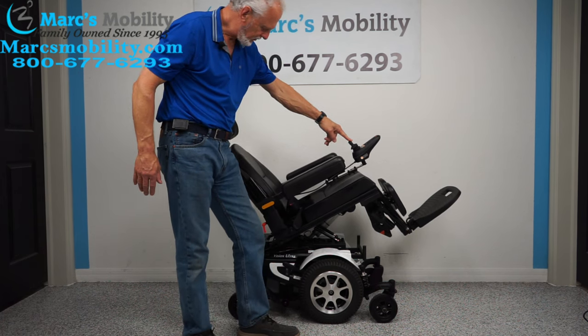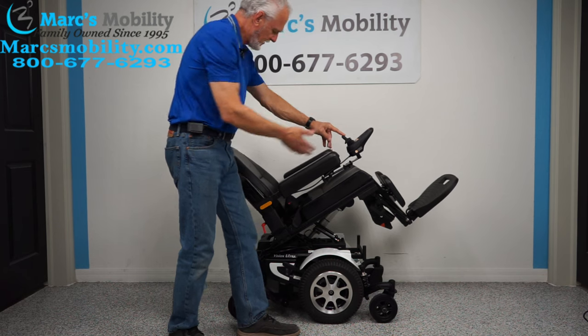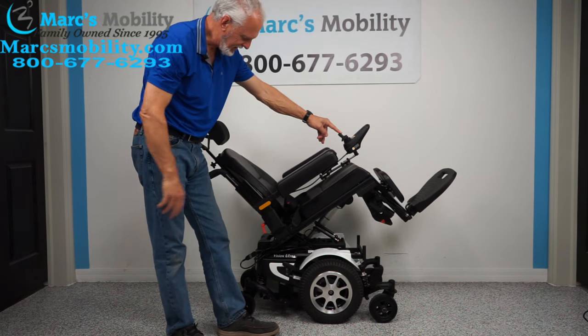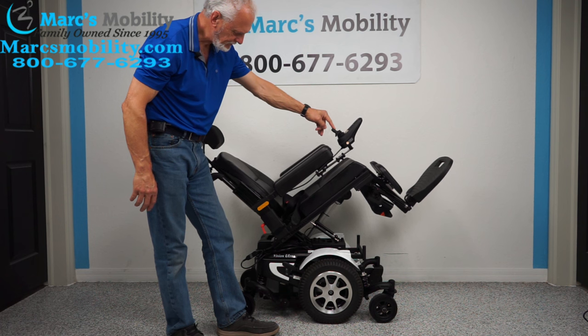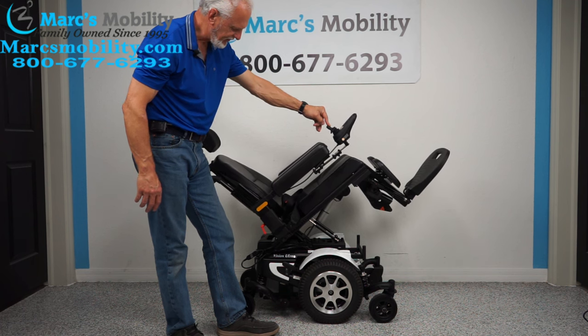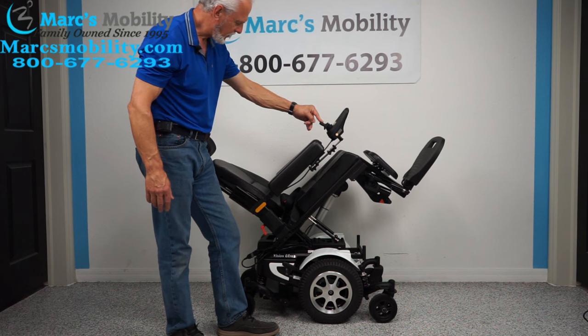This is called your electric tilt. When the tilt goes back, it takes the legs and it takes the back, as they're all connected together. So this is called your electric tilt. It's a slow tilt, which is good. We'll see how far it goes.